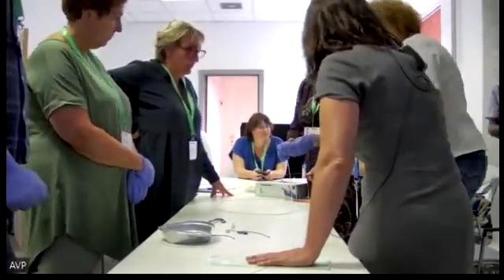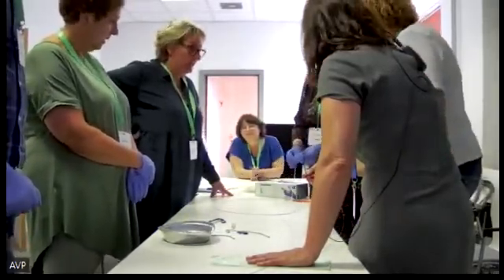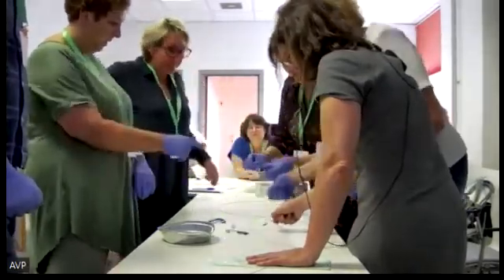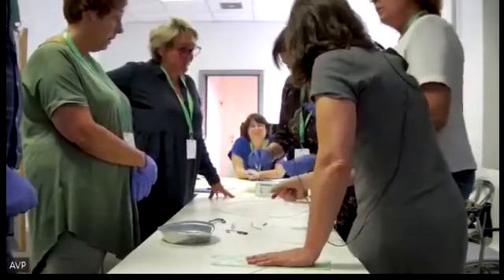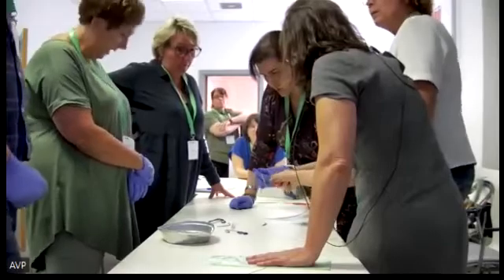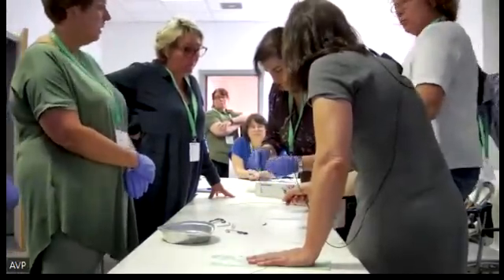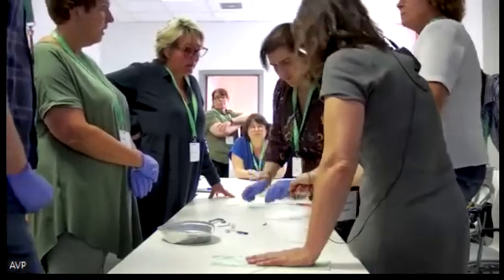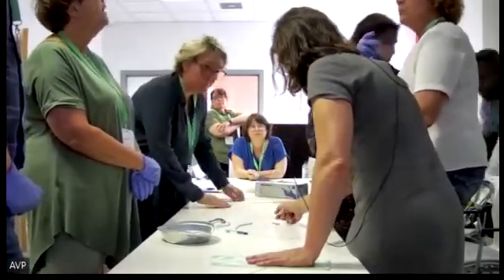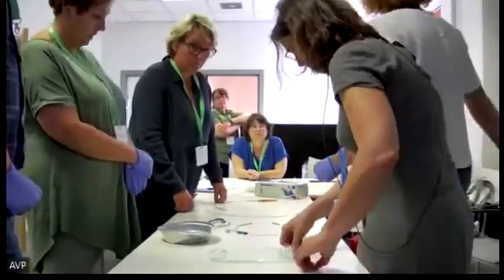You take your syringe with water. Okay, so where is the stent? Straight down. Always, if you put multiple stents, always the longer first and the shorter after. If you put the short one first and then push the second one, which is the long one, you may push the first one inside. If you put the longer one first, it's fine, I know the demo, don't worry.